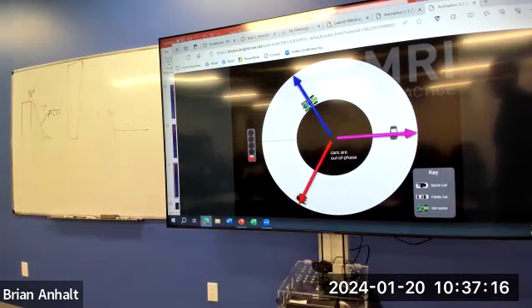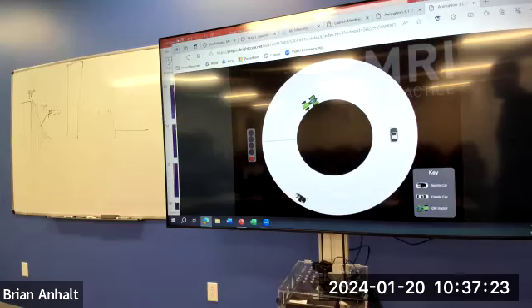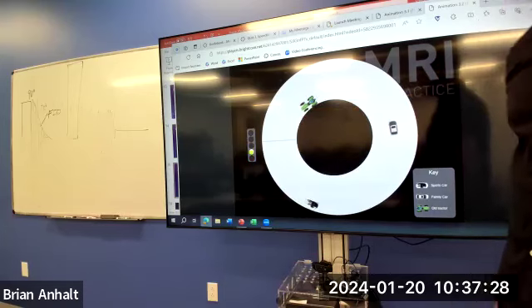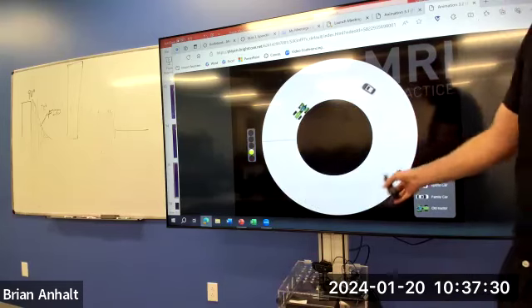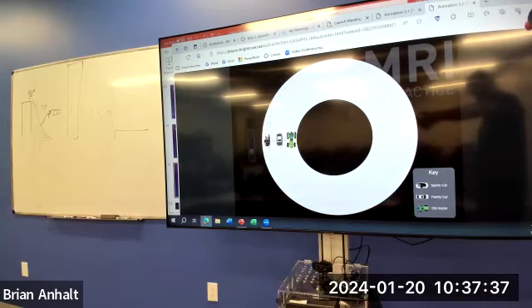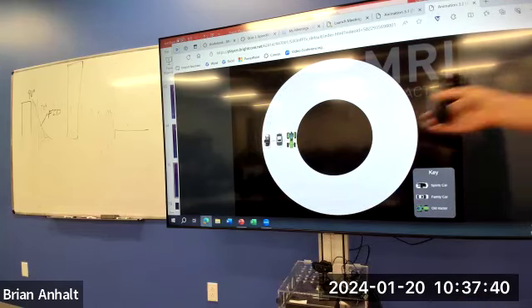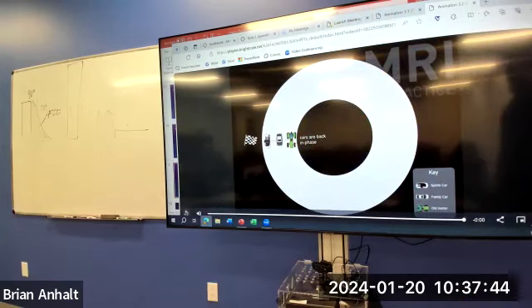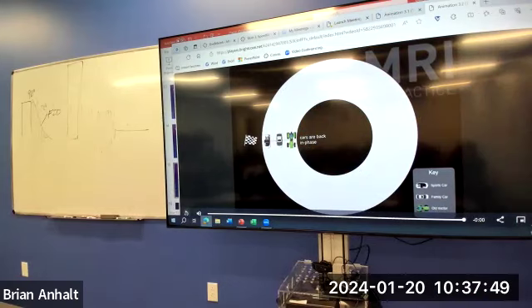Cars are out of phase at that point. Turn the cars around 180 degrees. The slow one is still going to be going slow, but it's ahead of everybody now, right? The faster one is behind, but it's faster. They come back together. The same amount of time between the beginning of the race and when they went 180 degrees is the same amount of time it takes them to come back into phase. Right? Feel free to watch those videos.